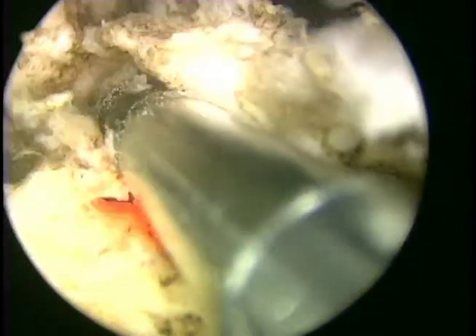Occasionally, as we work in a retrograde manner to remove pieces of tissue, we will find ourselves with a small stalk of tissue in which the base is close to the bladder neck. In order to make sure we simply cut this, I tend to put the laser fiber in contact with the mucosa and take short zips, pushing horizontally and almost pulling back the fiber so that we at least engage the tissue and bring it within the prostatic fossa. This is important to do to avoid any intravesical or ureteral orifice damage.